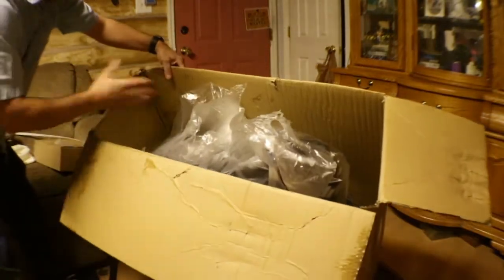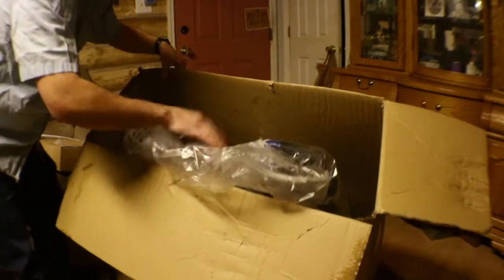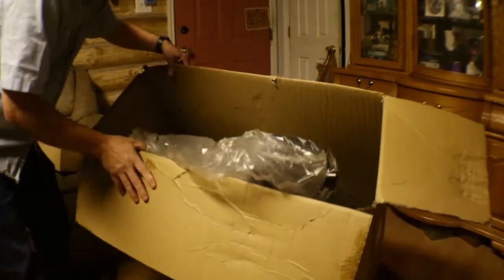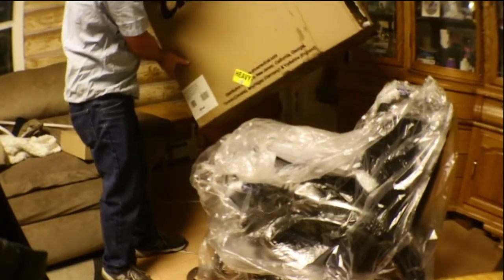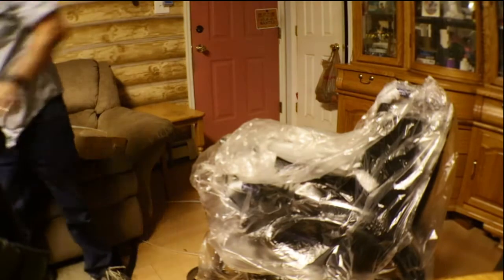The packaging is pretty good. The box was sitting outside, it's wrapped in plastic, and it's got some padding on the arms and stuff like that. As far as shipping, the box is ripped up pretty bad, but I don't think the product itself is damaged.